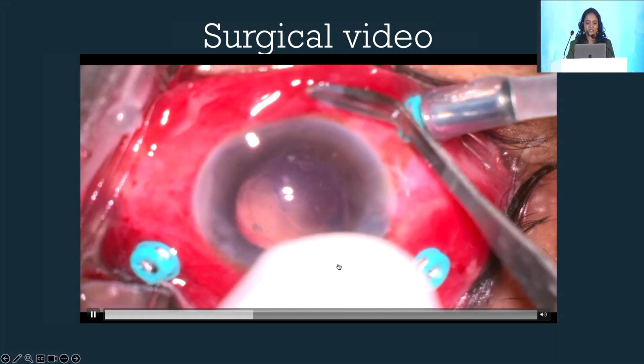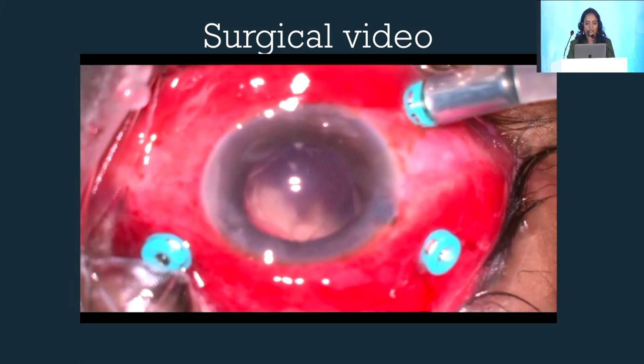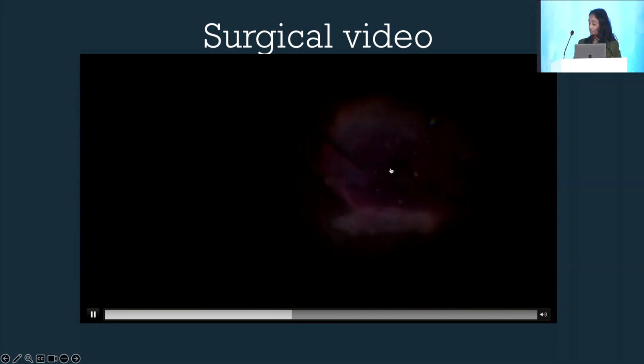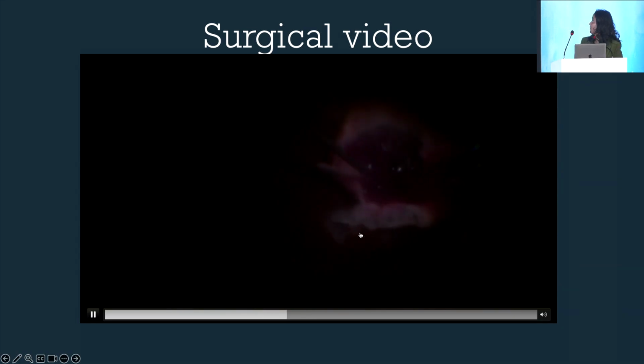So it will get better in a couple of seconds. So I decided to scrape the cornea and go in, and saw that this was the situation. There was a totally bunched up necrotic retina. I'll just show that again. This is all bare RPE that you can see.